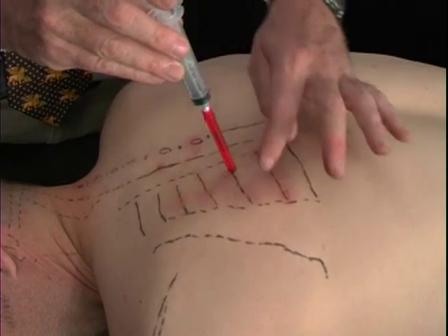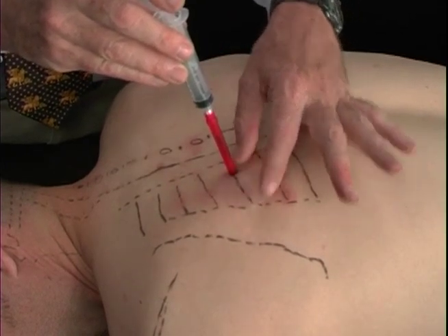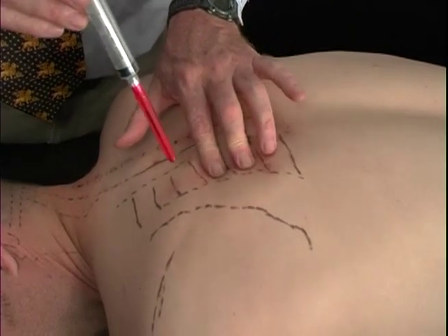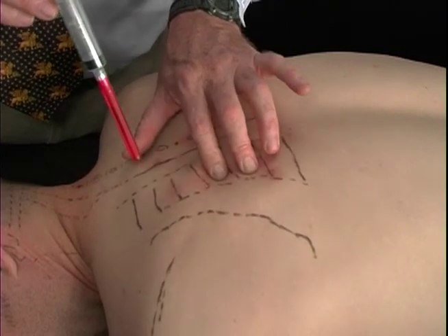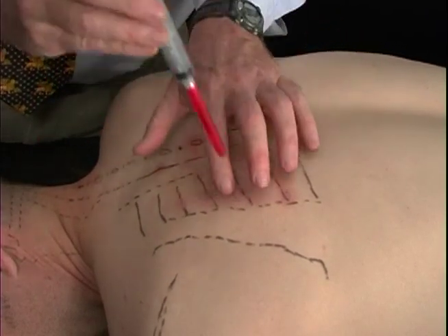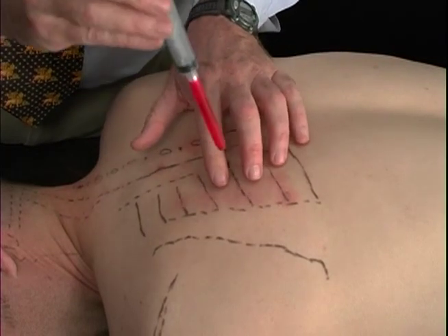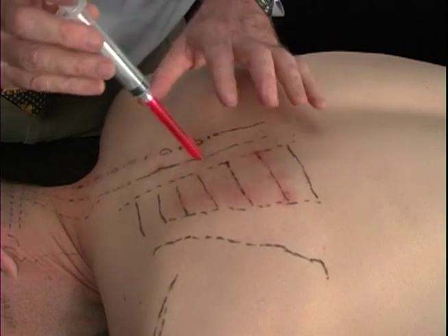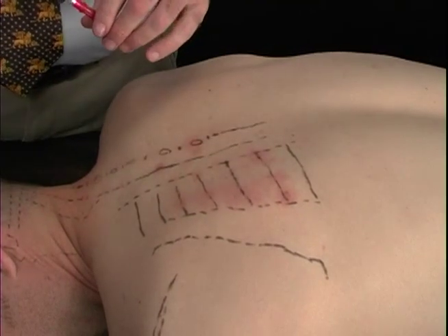So you can see that we started out here. We're now almost over to the rib transverse process junction using a skin sliding technique. When people are starting out with prolotherapy, I recommend just bringing your needle out, going back in and re-injecting, doing multiple sites. I think it's less confusing and easier to learn in that fashion.